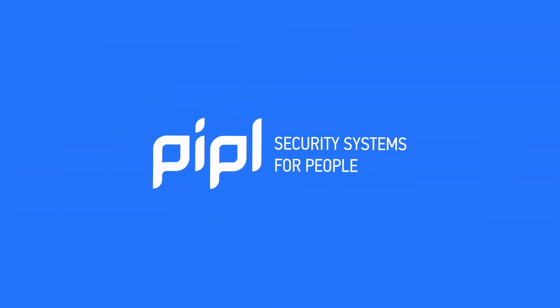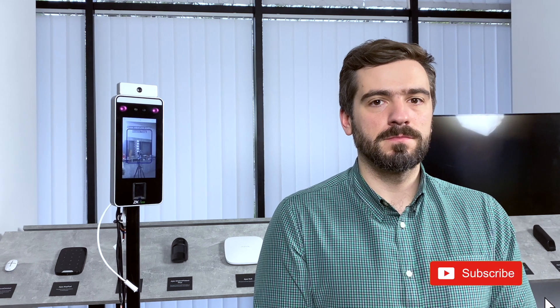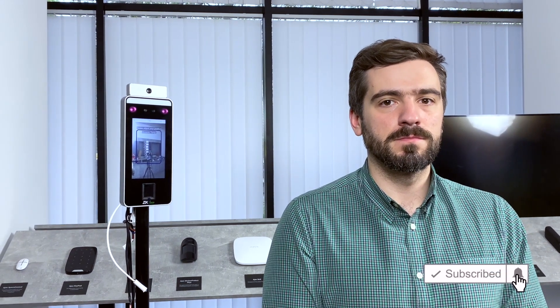This is Paul, my colleague. He is now going to be identified by this terminal, his body temperature is going to be measured, the system will tell us if he wears a mask, and this record with his attendance time and temperature measurement results will be saved as an event in the database.